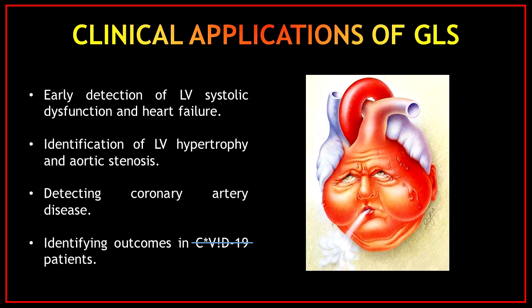Among the clinical applications of global longitudinal strain we have the early detection of left ventricular systolic dysfunction and heart failure, identification of left ventricular hypertrophy and aortic stenosis, detecting coronary artery disease, and of course, identifying outcomes in patients with this famous virus.